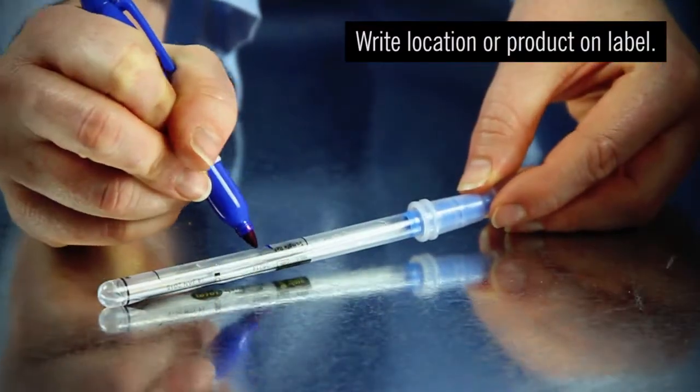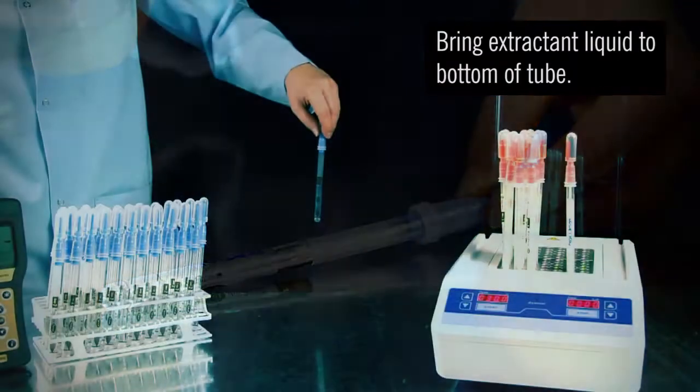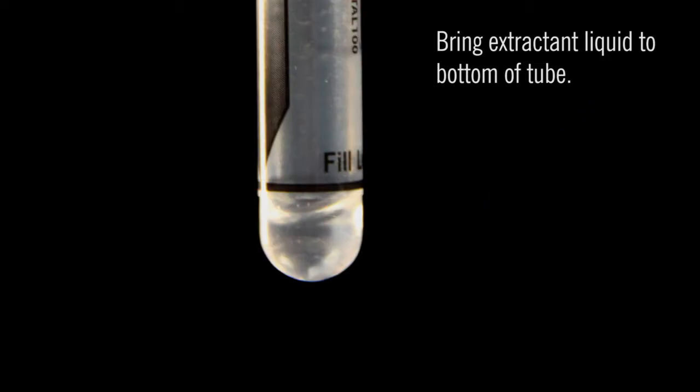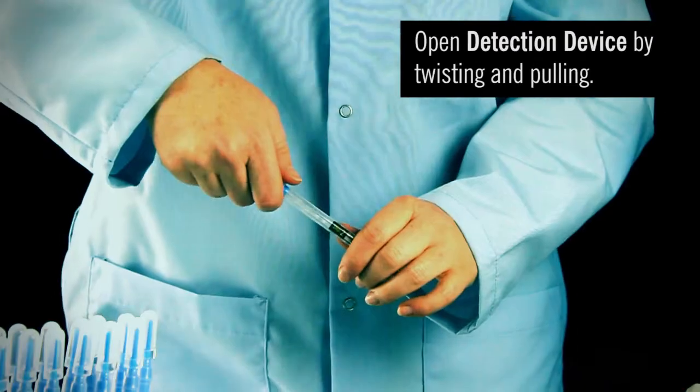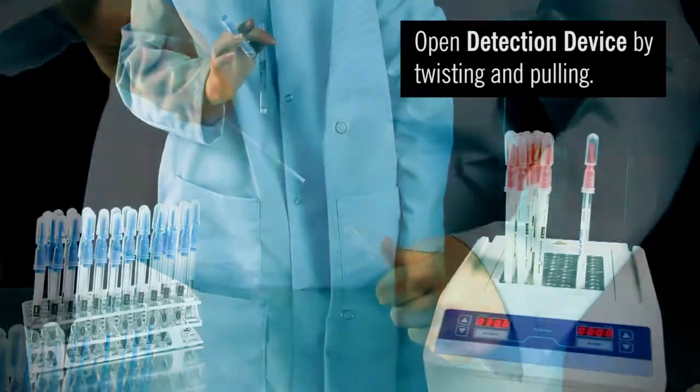Write the location or product on the swab tube label for easy identification. Holding the swab upright, forcefully flick the device in a downward motion. This will bring droplets of chemistry to the bottom of the tube. Twist and pull to remove the snap valve from the detection device tube.